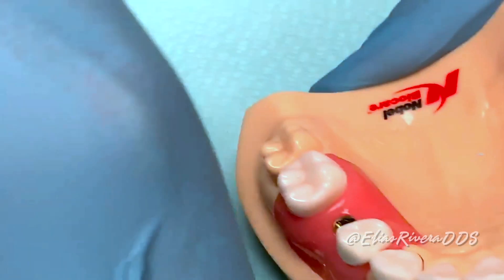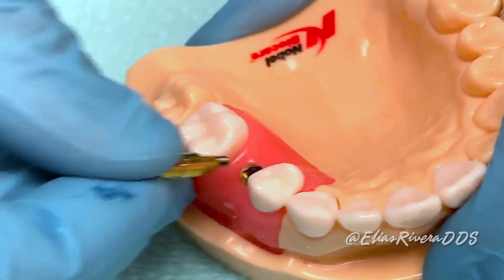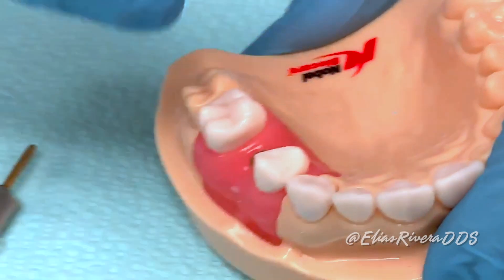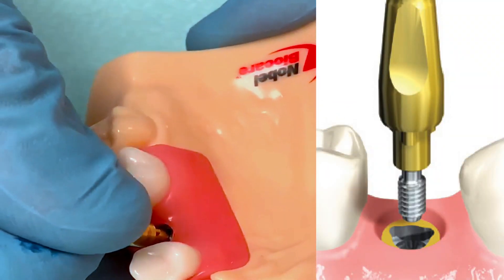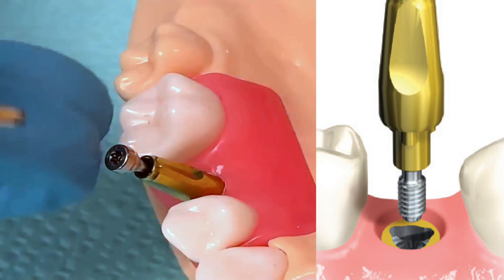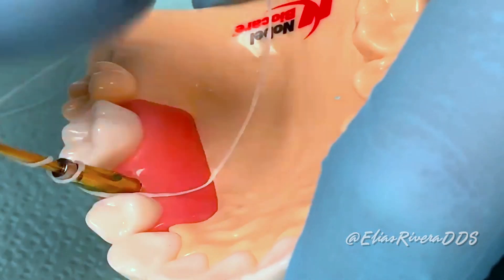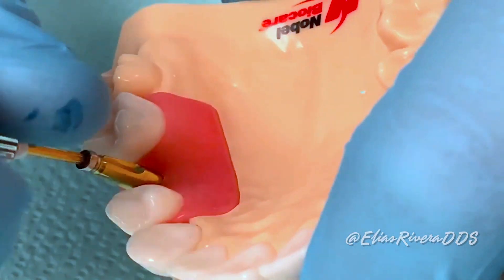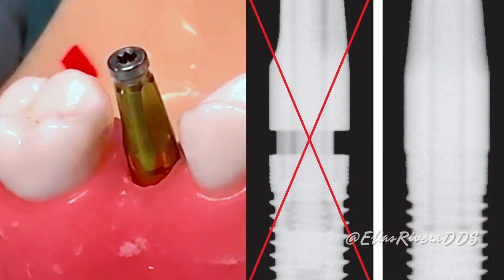Step number two: insert the closed-tray impression coping into the implant. Ensure that the lobes of the tri-channel configuration of the impression coping engage the tri-channel connection in the implant. Once it's seated, use the screwdriver to fasten it. In the clinical scenario, a radiograph will be needed to verify proper seating of the impression coping.